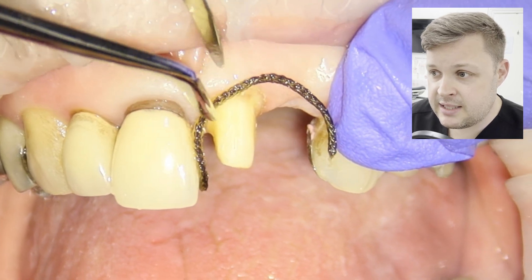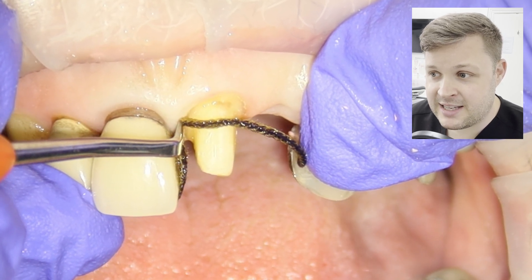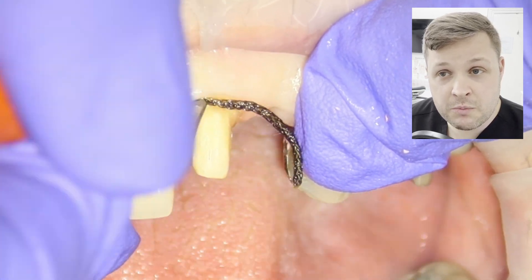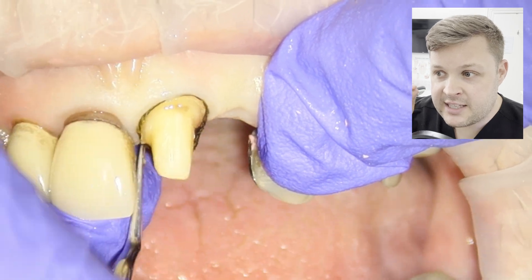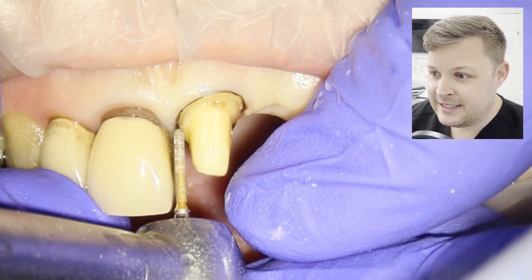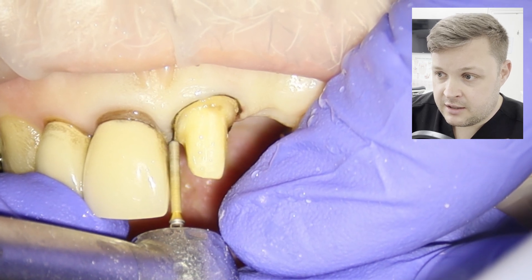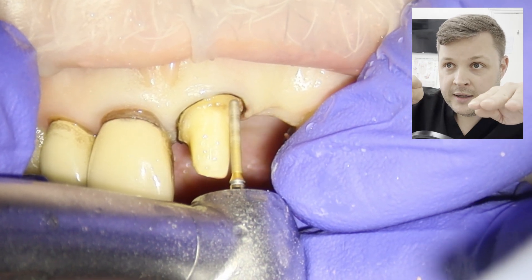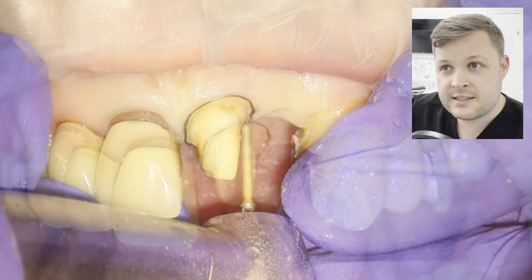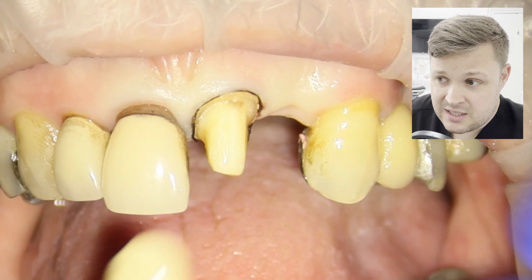Next I'm going to use retraction cord with astringent. I have a very special thin flat plastic that can really get into the gingival sulcus nicely. Some flat plastics have quite a thick blade, but this is my favourite — no one's allowed to touch it. Once the gingiva is retracted, I recheck the prep, and sometimes the shoulder margins have little peaks on them that need to be removed ever so slightly.